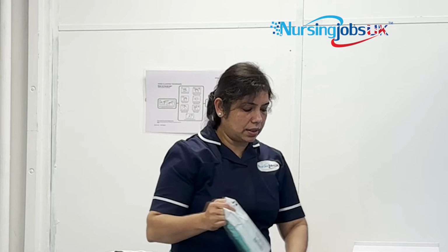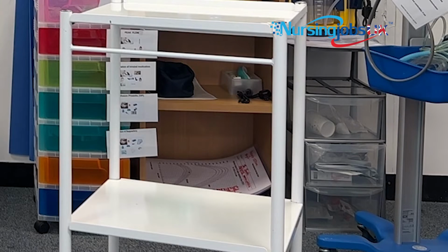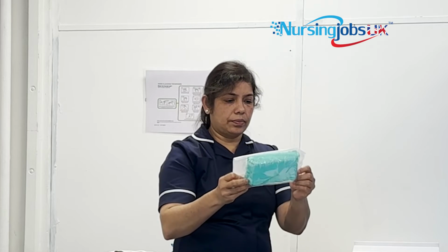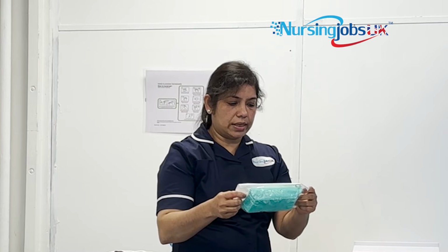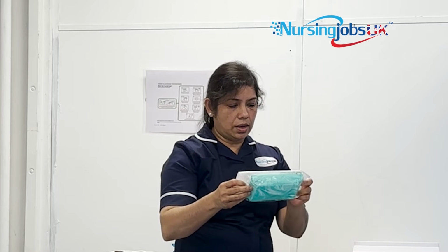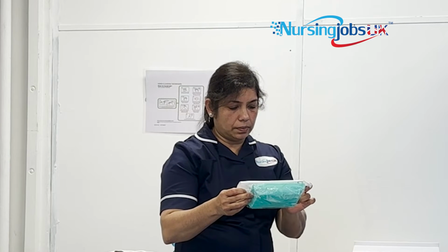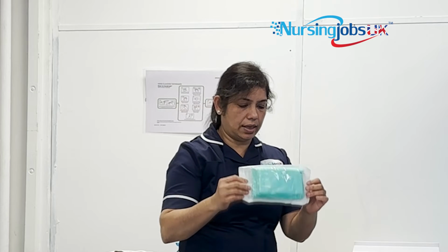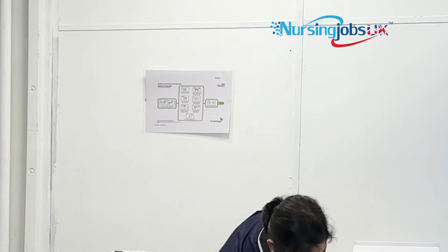All the equipment you need, you arrange on your bottom shelf. So you need a dressing pack. The dressing pack is intact. The expiry date is March 2026. So it's intact and in date, so I can use that one.